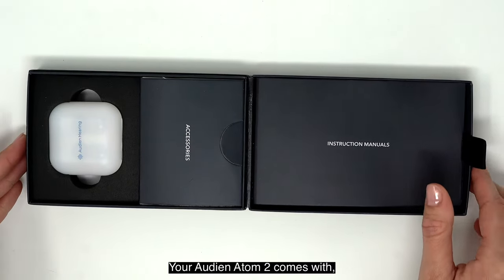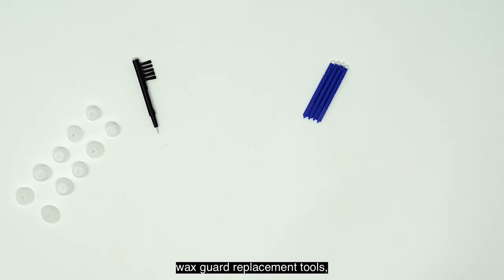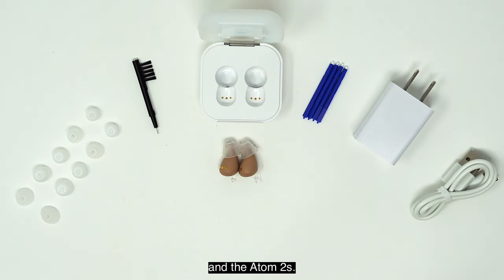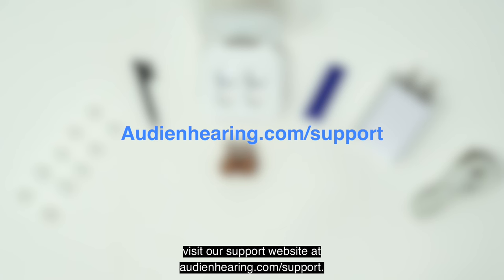Your Audien Atom 2 comes with different sized ear domes, a cleaning brush, wax guard replacement tools, USB charging cable and wall charger, charging dock, carrying case, and the Atom 2s. For any additional resources, visit our support website at audienhearing.com/support.